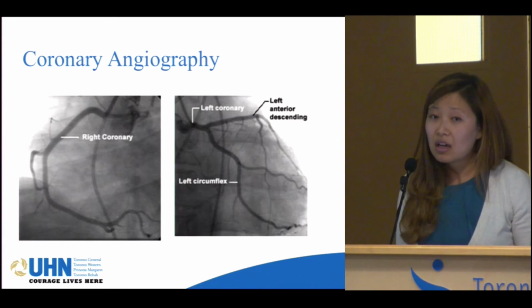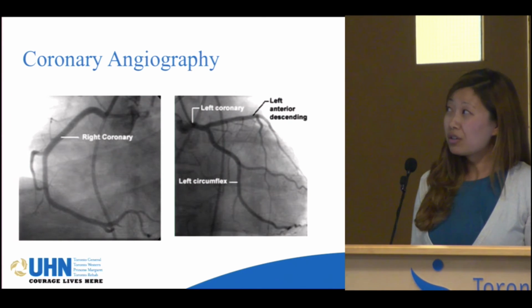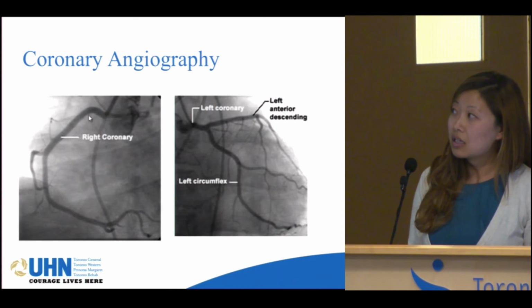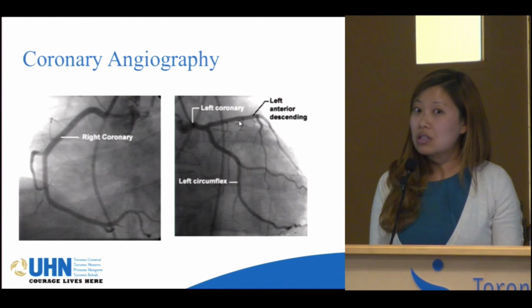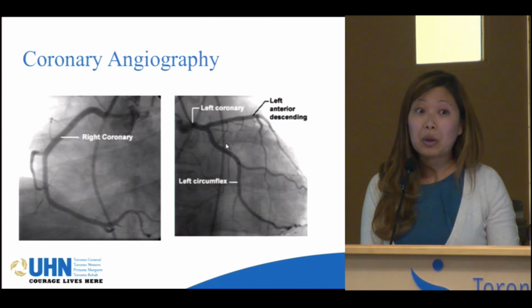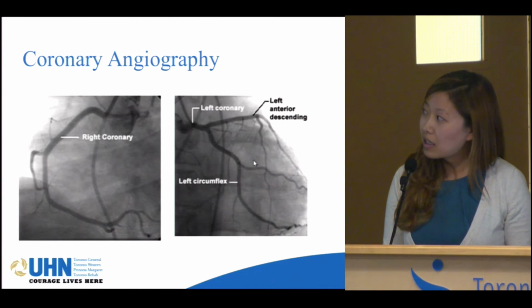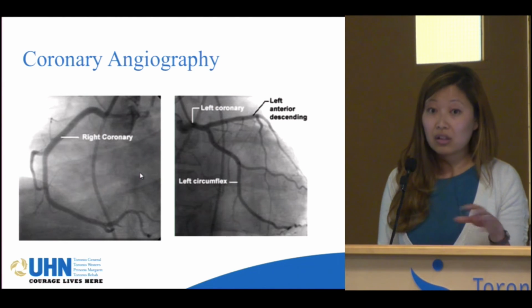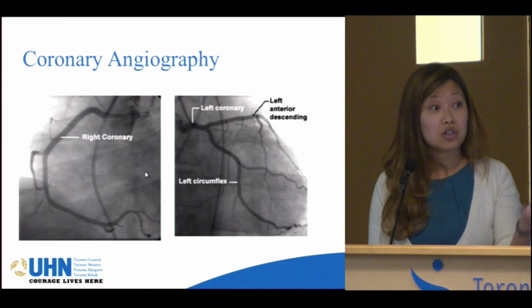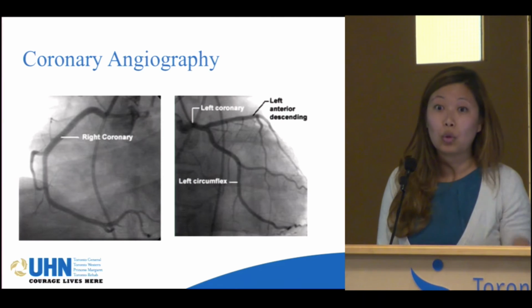Now this is what they see as an angiography. You get your basically three main arteries. You have your right side on this side here, then you have your left side, and it breaks off to the circumflex or the left anterior descending. This one's also known as the widowmaker. So these are the four main areas that they look at, and then there are all these tiny little arteries that branch off. They're smaller, so they're definitely harder to get to, and that's why sometimes the doctors may say to you, we didn't get to everywhere, we're just going to leave certain spots, but they do definitely look at these four main areas.